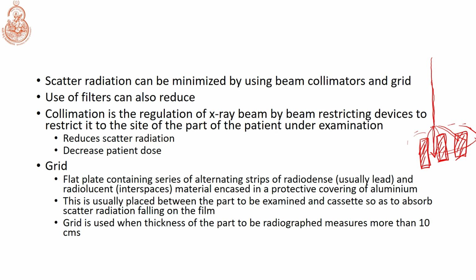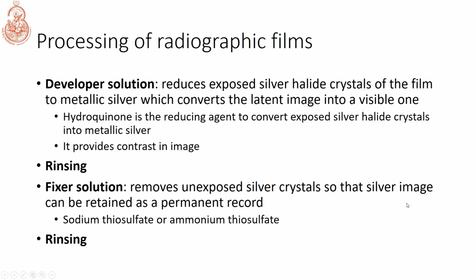It will just allow the information carried by those photons passing directly through the part to be radiographed onto the cassette, so the film will not have any unusual information that would lead to a wrong diagnosis.